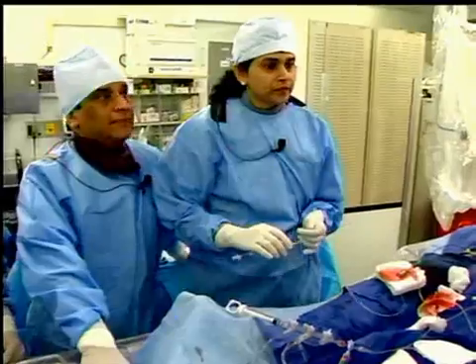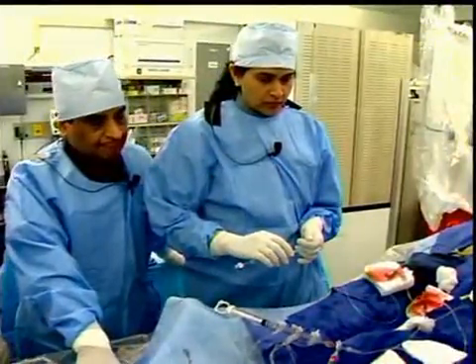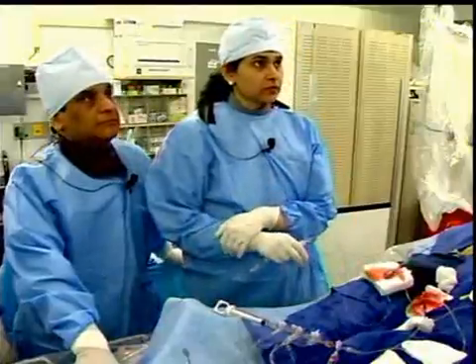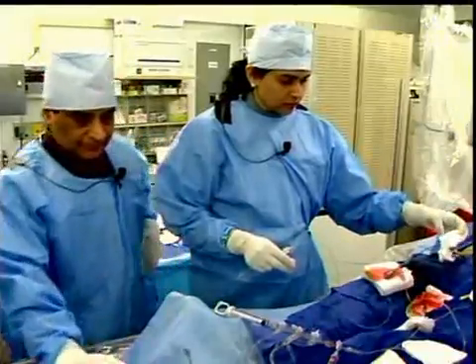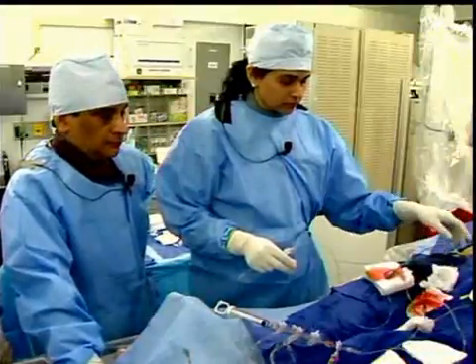I'm actually quite impressed that despite 2 vein grafts closing, the ejection fraction has almost improved after a year. And the other impressive part is that indeed you have a very angulated left circumflex coming off the left main. Looks almost an ideal case to attempt with the Venture catheter, which I have always kind of figured out as a mini Amplatz guiding kind of catheter, which provides you support from the contralateral wall and still has the deflectable tip. So good luck with that.